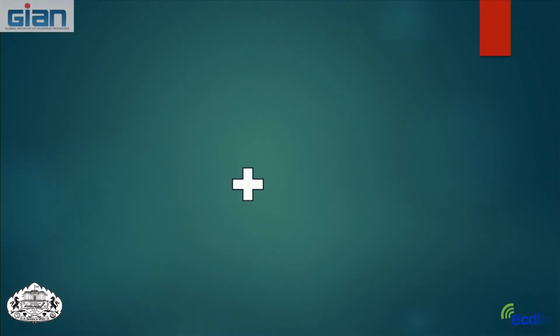Okay, so here's the faces task. Again, we're telling them respond as quickly as possible. Press index finger for female, middle finger for male. We're going to see blocks of 6 faces, and within 19.5 seconds, that's the duration of these. Now, I don't think I have the timing exactly correct here. I just wanted to show you the examples. This is what they're actually seeing.